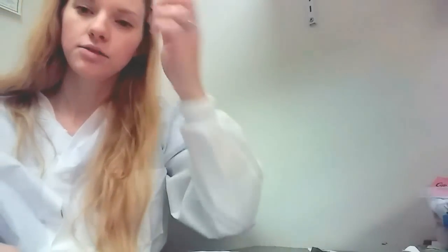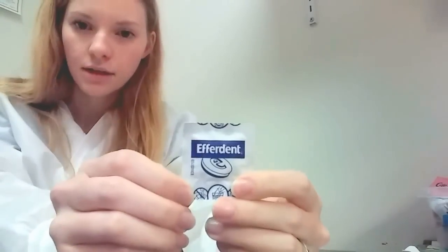So here is a little chart. When a person goes into the bathroom, we will turn off the water, flush the toilet so there's no water in there, and then we put one of these little tablets, and that turns the water blue. So obviously if they're trying to dilute it out, the sink tap water would be off, and in the toilet you can obviously see there's blue in there, and it would be blue in their cup.